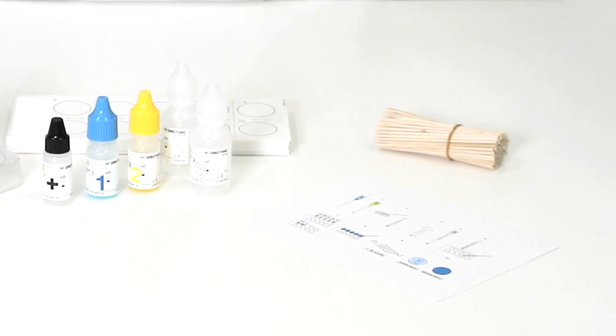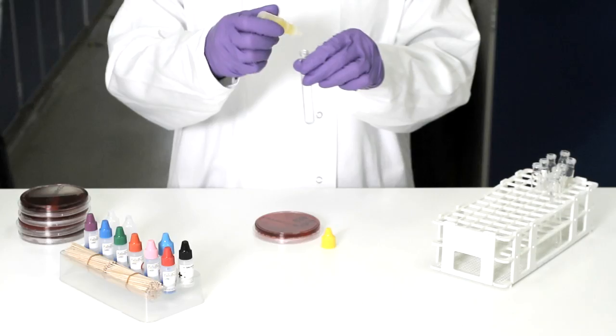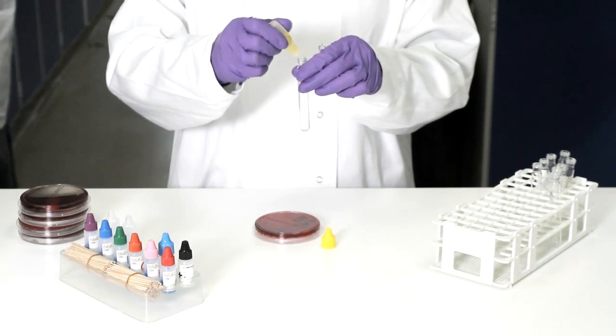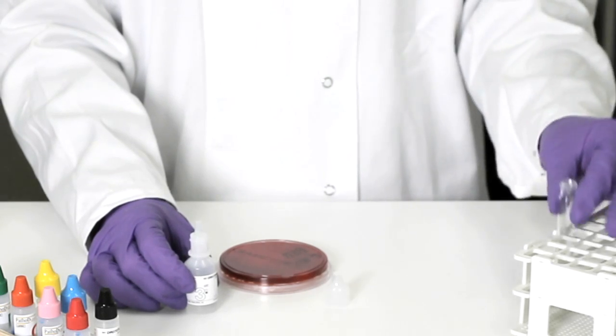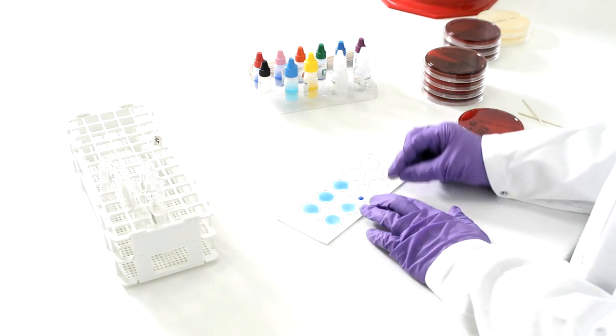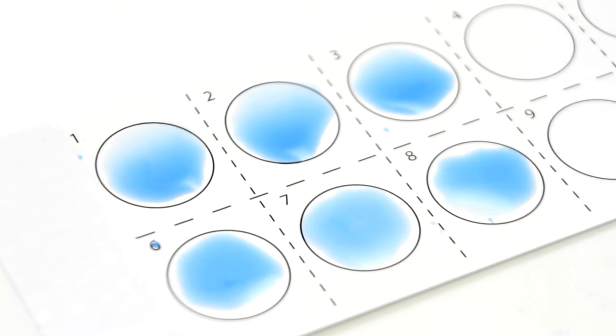Here's how quickly it works. Simply emulsify the test organism in a single drop of reagent 1. Add reagent 2. Mix and neutralise with reagent 3, and the extract is ready to test. Then mix drops of extract onto the reaction card with each of the group reagents.